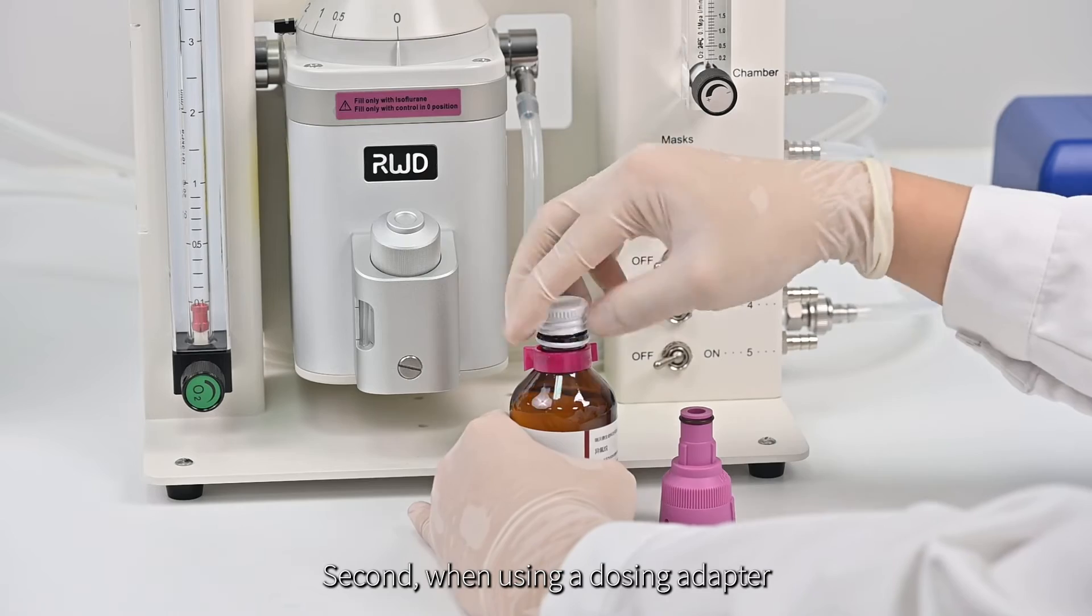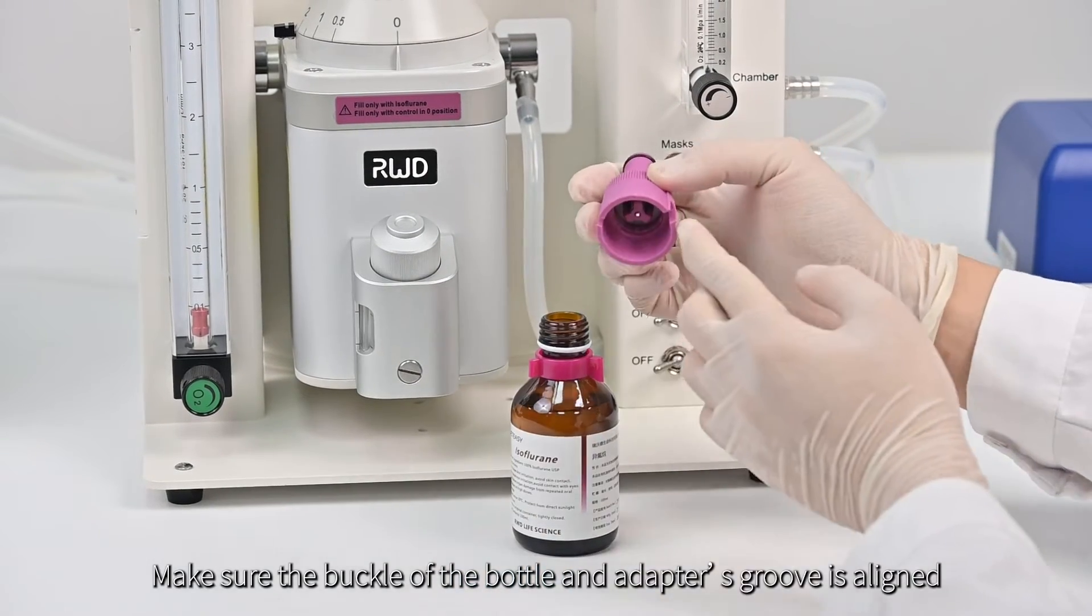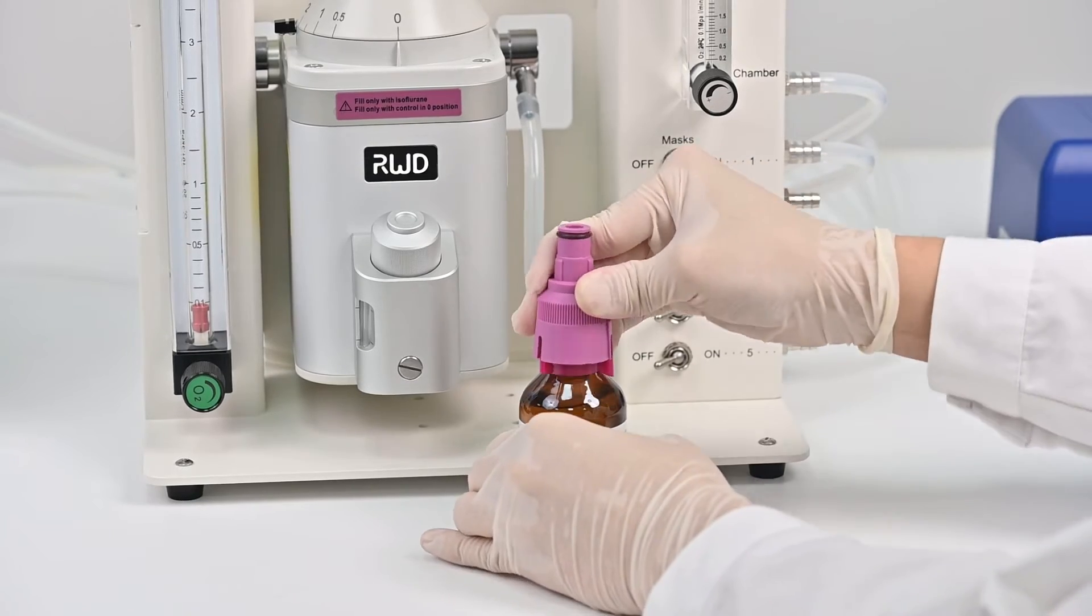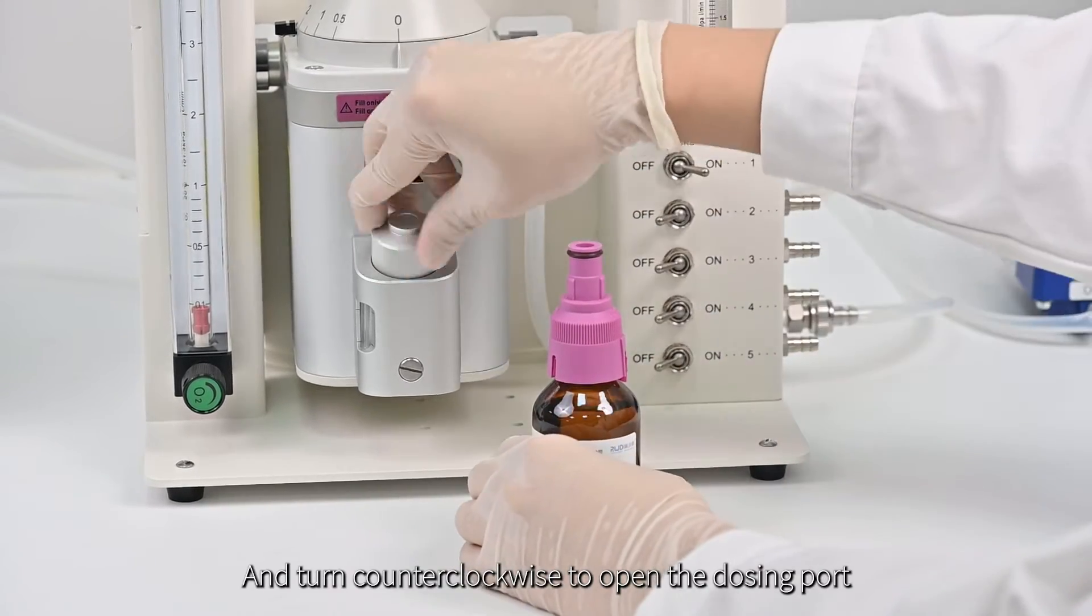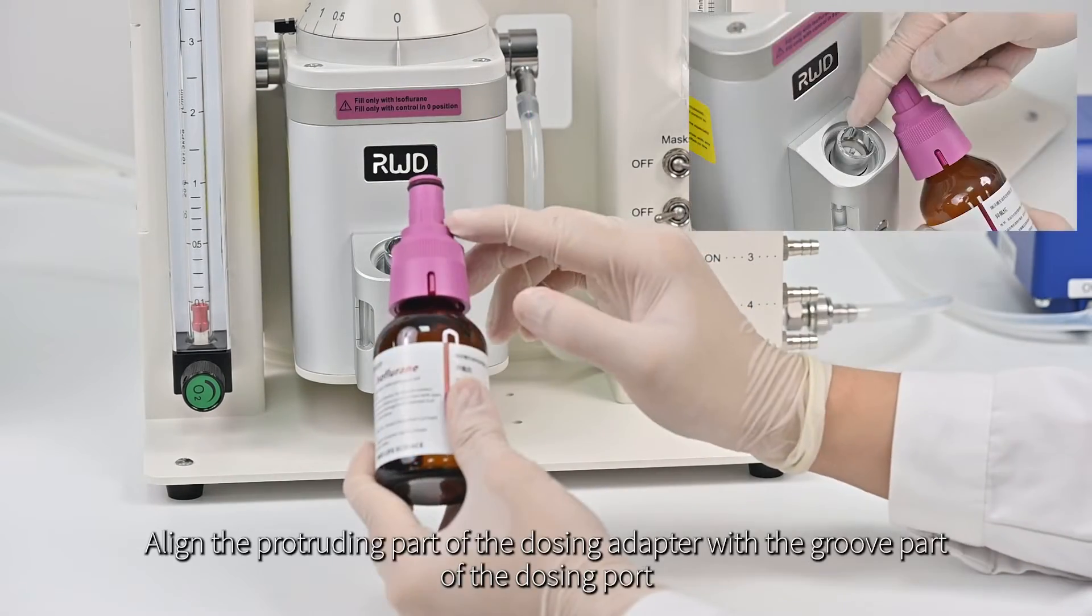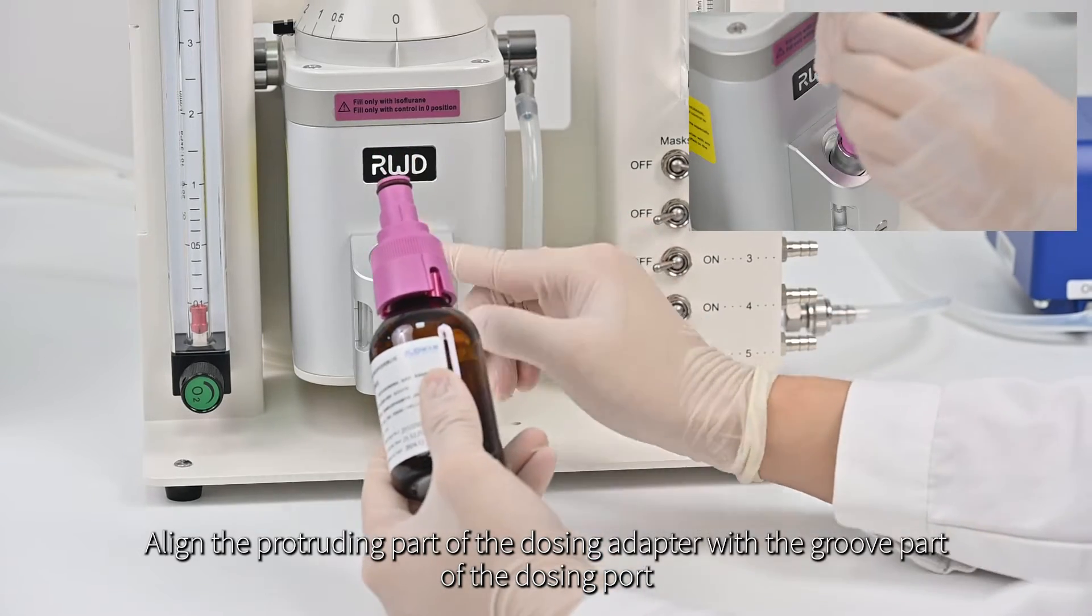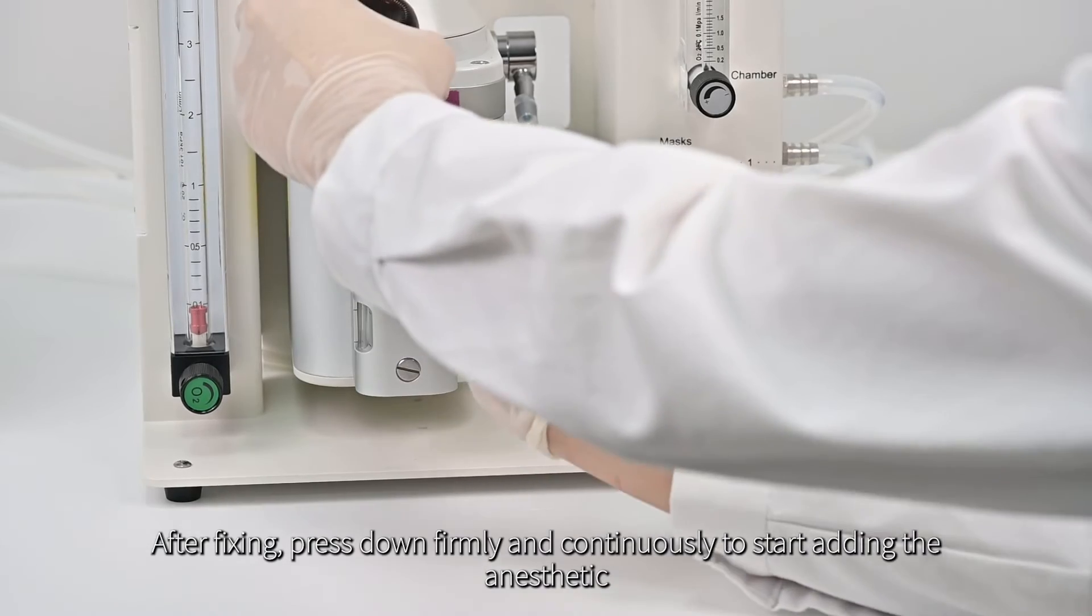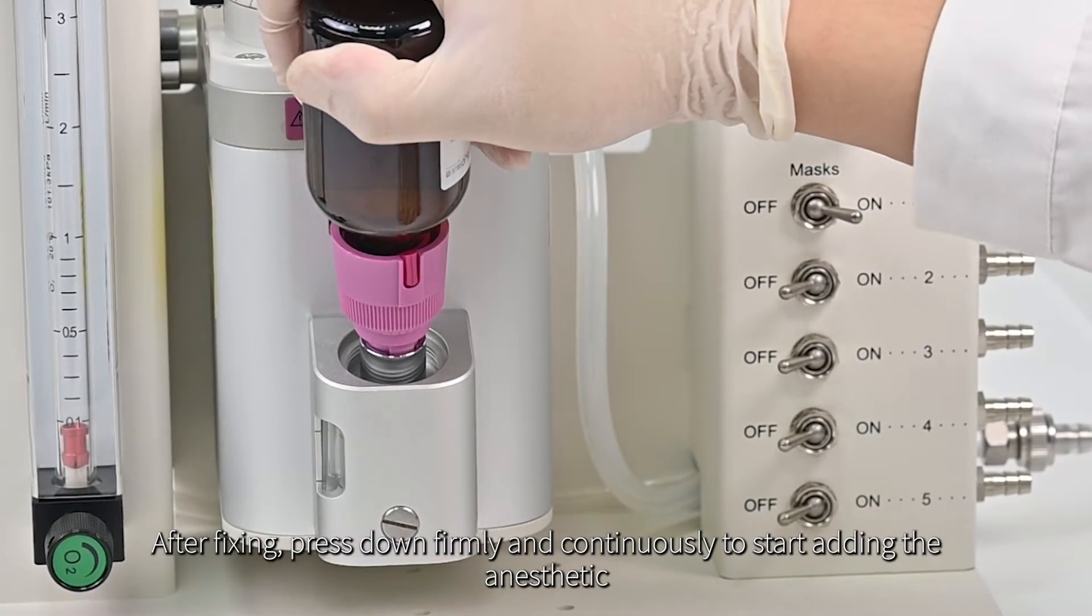Second, when using a dosing adapter, make sure the buckle of the bottle and adapter's groove is aligned. Rotate the adapter to secure it, and turn counterclockwise to open the dosing port. Align the protruding part of the dosing adapter with the groove part of the dosing port. After fixing, press down firmly and continuously to start adding the anesthetic.